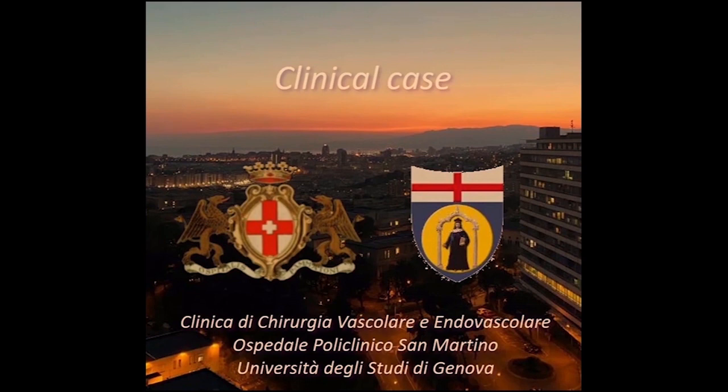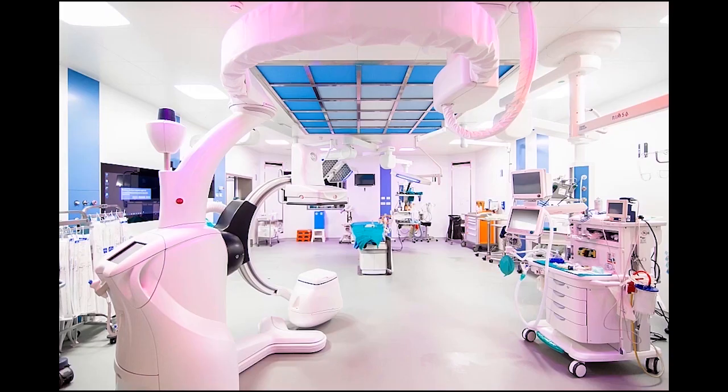I am a professor of vascular surgery and head of the Clinic of Vascular and Endovascular Surgery at the Ospedale Policlinico San Martino, University of Genoa. I thank the GE for the opportunity to present a clinical case today from our new hybrid room setting, which has recently opened last summer and is fully equipped with a new generation of Discovery system.